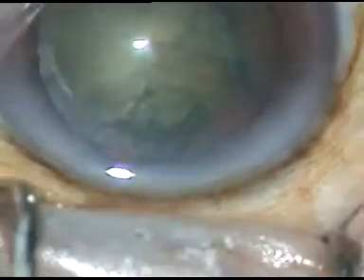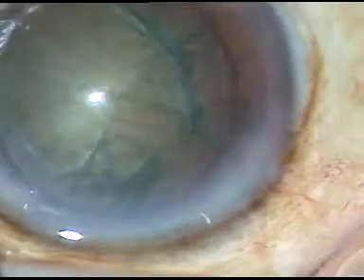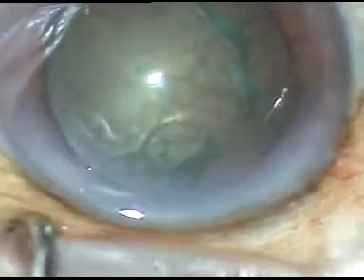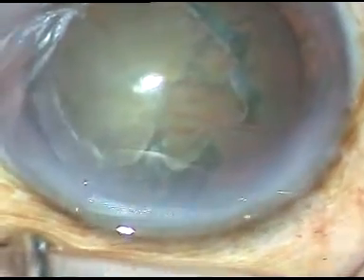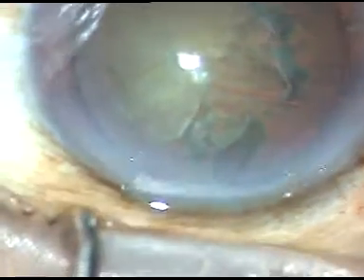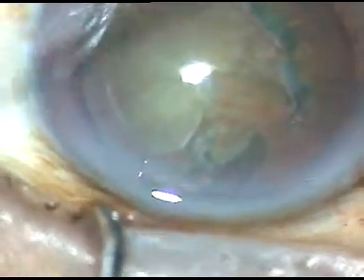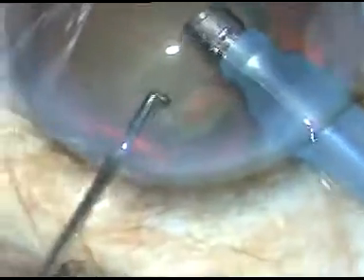And now is the time to enter into the eye with the phaco handpiece. This is the Oertli Catarex easy phaco machine. The phaco tip is introduced. I am in phaco 2 mode from the very beginning.